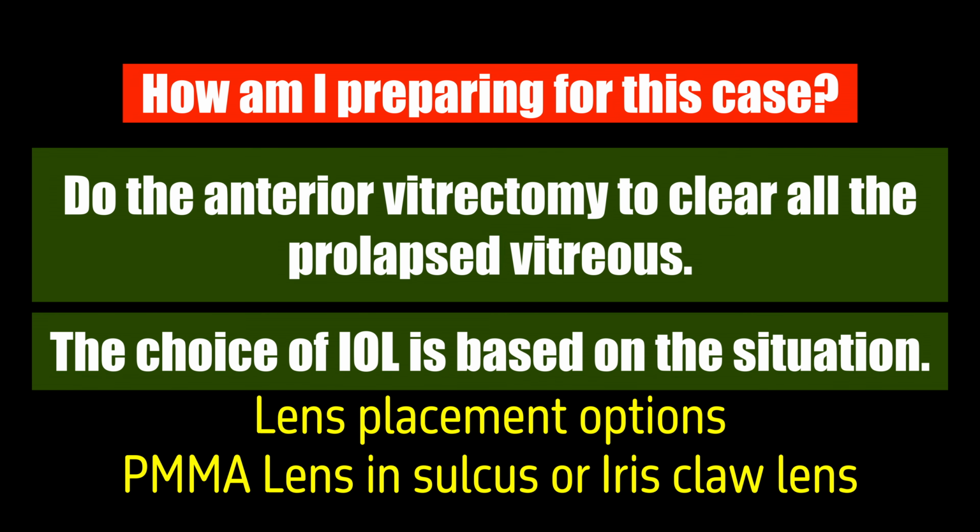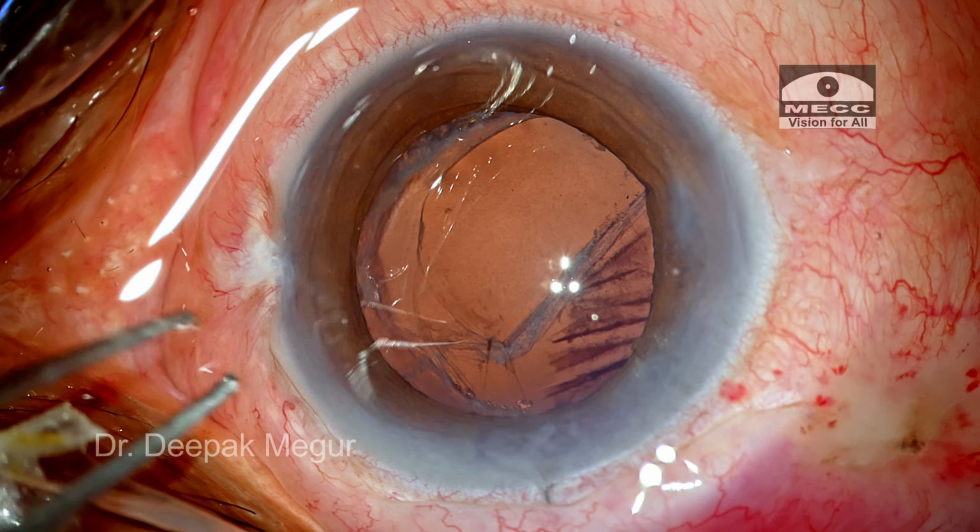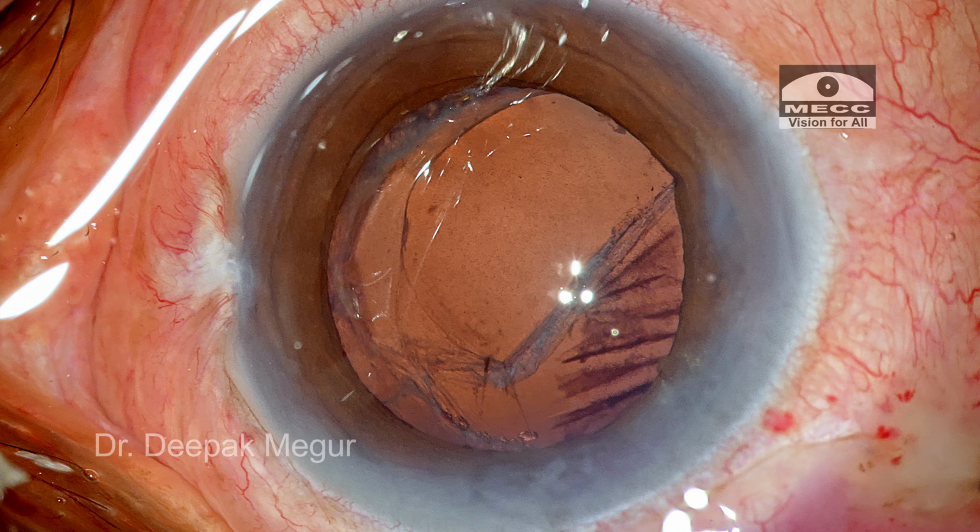Well, if there is not adequate capsular support, I don't see the rhexis good enough, then I would resort to the iris claw lens, which is posteriorly fixated. So this is the picture in the OR. Patient has received a peribulbar block, and this is how the eye looks.